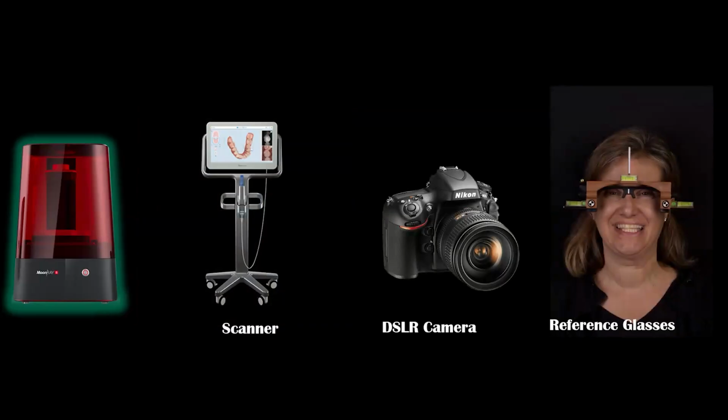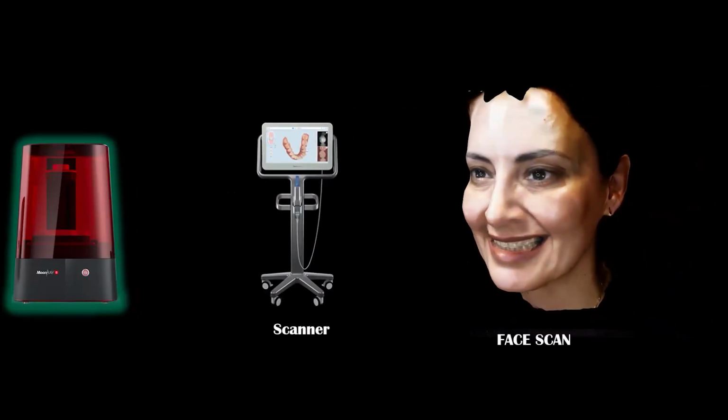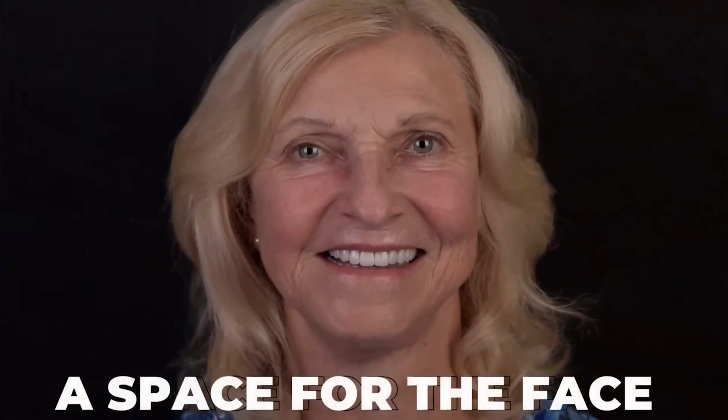Now, the nice thing about the face scanner is it replaces the camera, the photography, in a more efficient way, because now instead of just seeing one view of my patient when I'm designing, I get all views of my patient when I'm designing. One of the biggest benefits we get when we do digital designing is a space for the face.